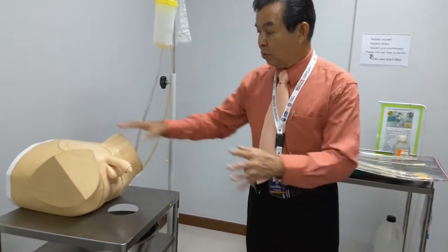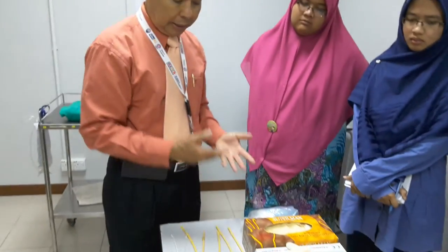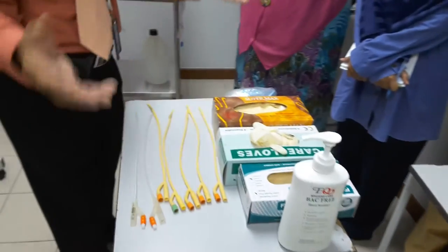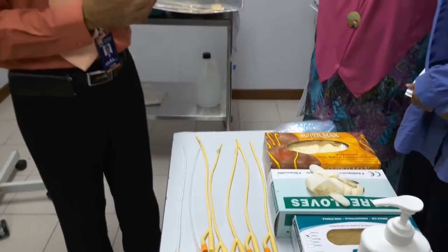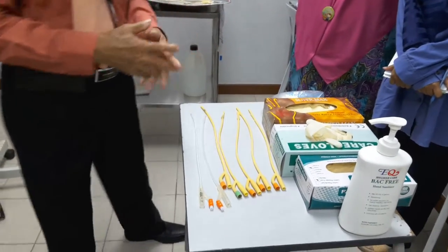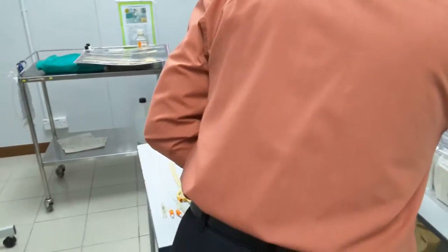After washing, I want to show you the equipment we use. First, wash with the solution — one, two, three — using tap water. After that, wipe it down and then put on the glove. I'll show you how to put on the glove properly.